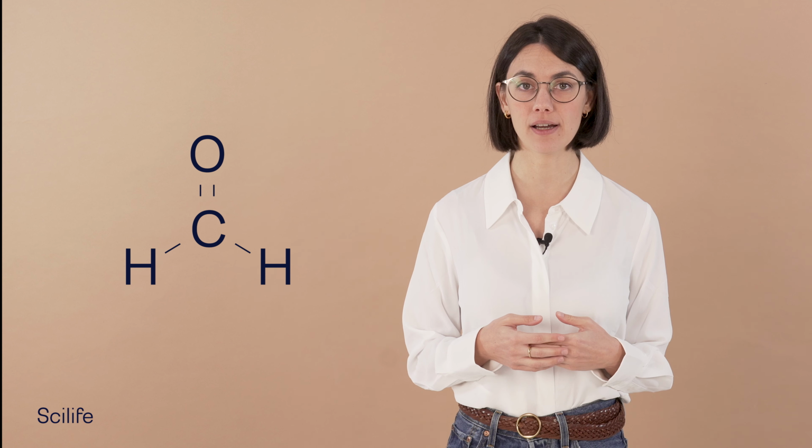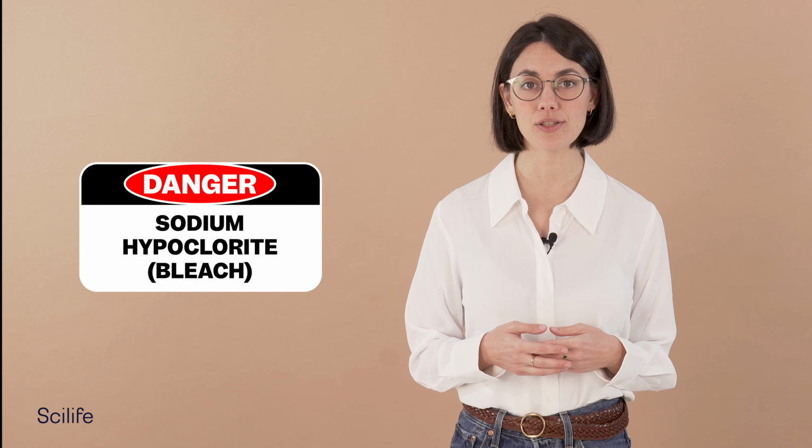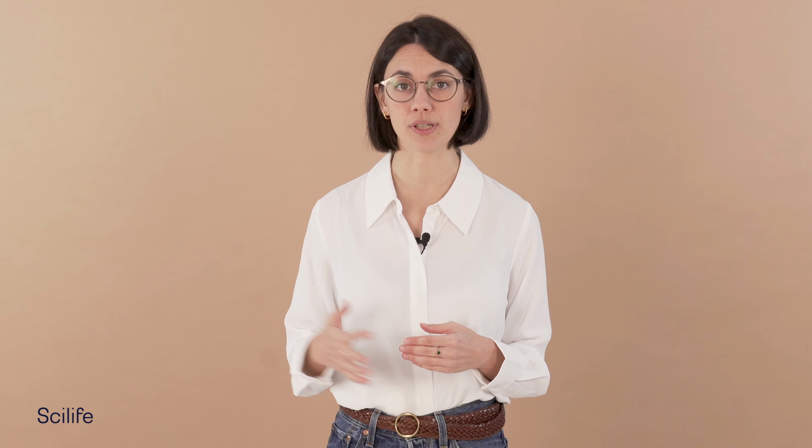There are other chemicals that are used for sterilization or even disinfection, like glutaraldehyde and formaldehyde, peracetic acid, ozone, bleach, and chlorine dioxide. Formaldehyde, glutaraldehyde, and chlorine dioxide are gases and are commonly used to sterilize clean rooms. It is essential to ensure that the sterilizants are compatible with the device being sterilized. The selection of an appropriate sterilization method requires a thorough understanding of the medical device, the drug substance, as well as the final product characteristics.